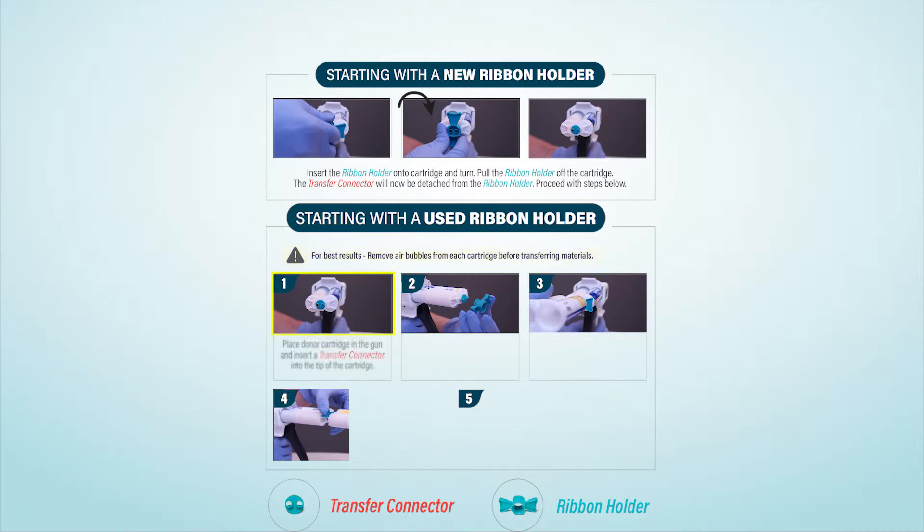Place the donor cartridge in the gun and insert a transfer connector into the tip of the cartridge. Insert the ribbon holder onto the cartridge, using the arrow indicators to properly align as shown.